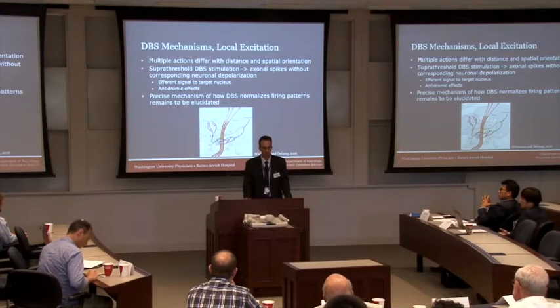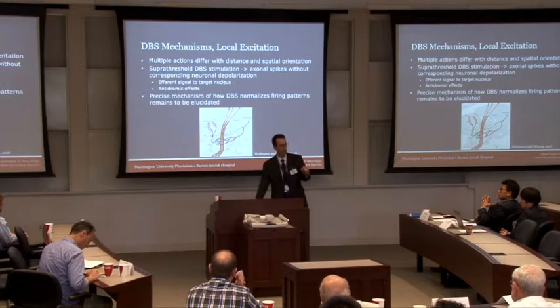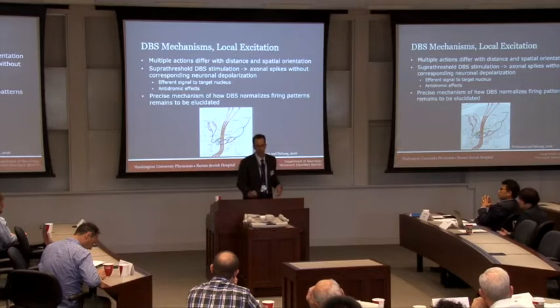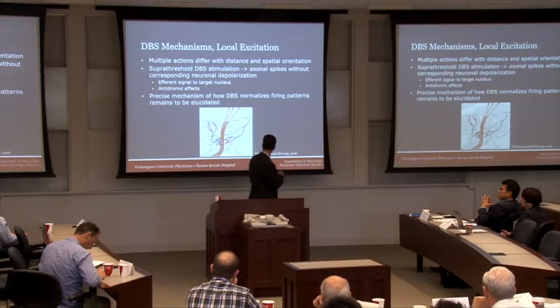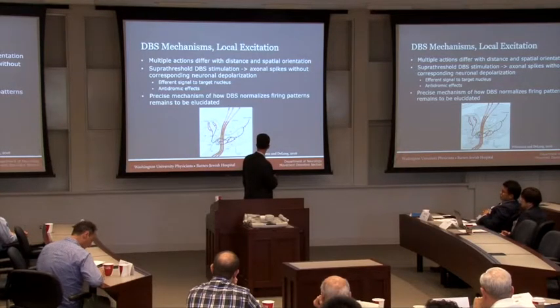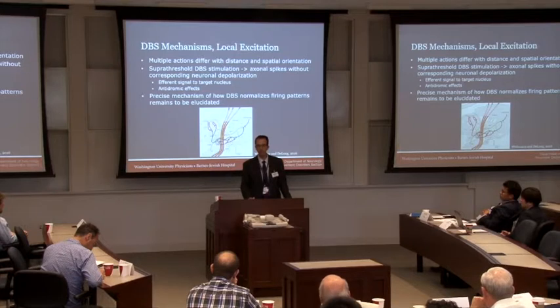processing. And so now things get a lot more complex because not only are we sending signals locally and inhibiting neurons, but we're also sending signals efferently up the chain, but also backwards antidromically, because we have those presynaptic axons that we're stimulating in the local field of effect. So the precise mechanism of DBS is very complex at this micro level, and this plot here I'm demonstrating really to suggest the locality. This really is that 5 millimeter span here, and when we expand our current, we start hitting a lot of different pathways that are crossing paths here, and thinking about those axons that pass through there is important in further developing our circuits going forward and the mechanisms.